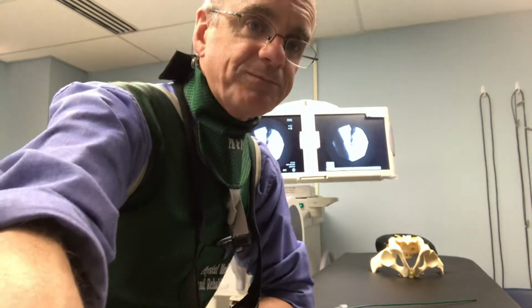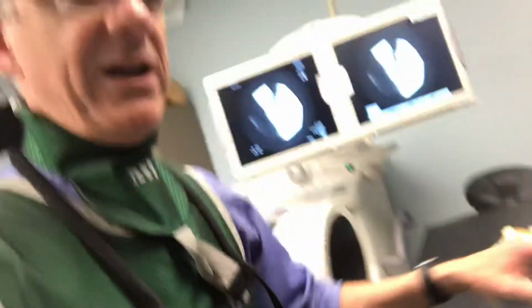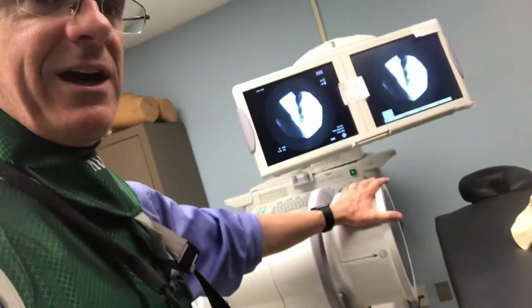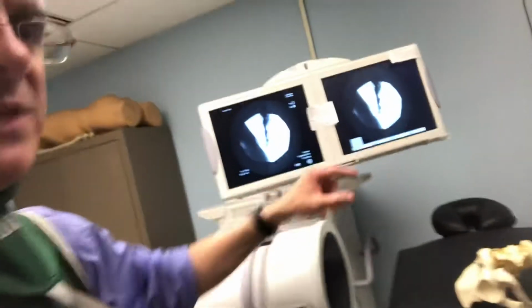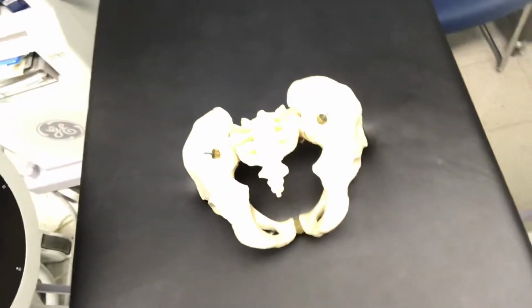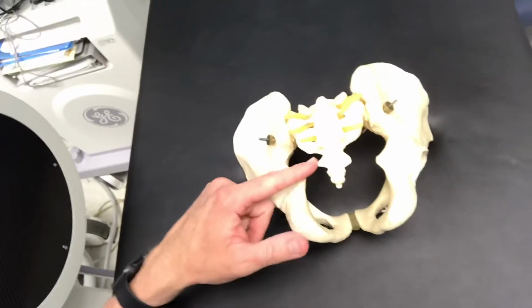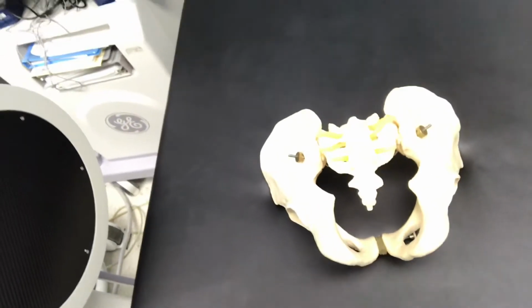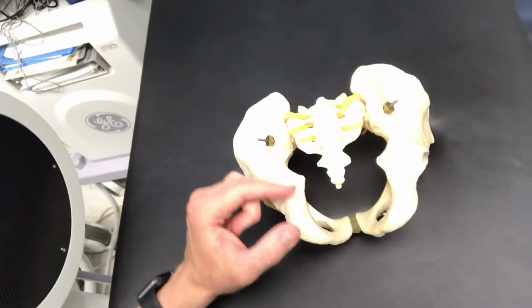So just to show you a little bit of how this works, this is the fluoroscopy machine, and the monitors up here behind me, and on the table here I have a plastic model of a pelvis, where the coccyx is right down here at the lower part of the spine.